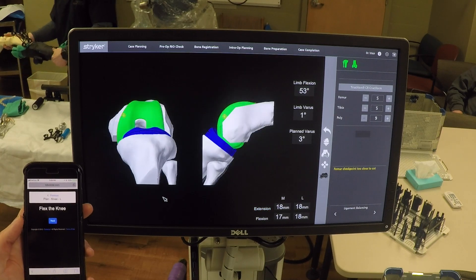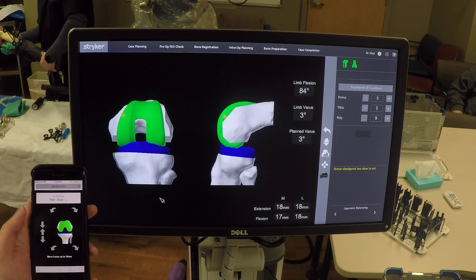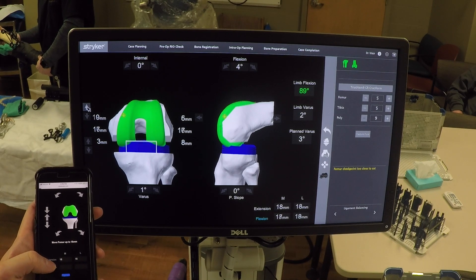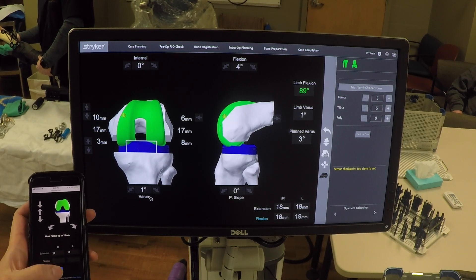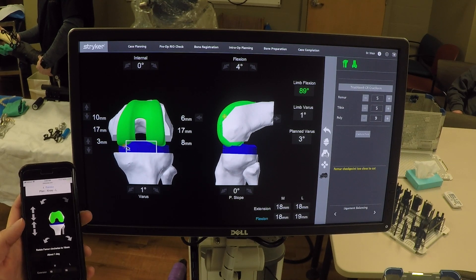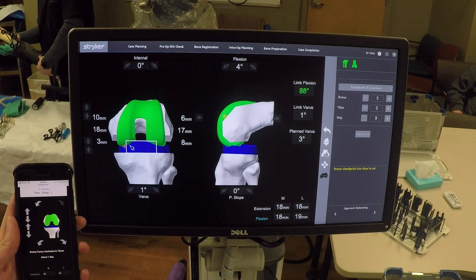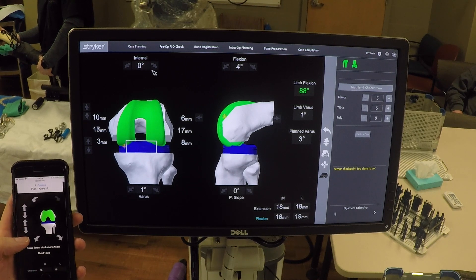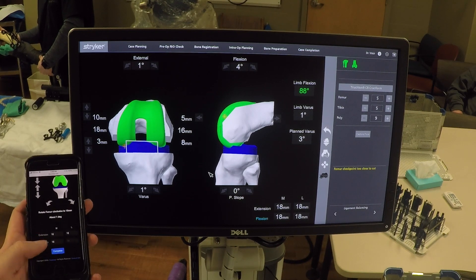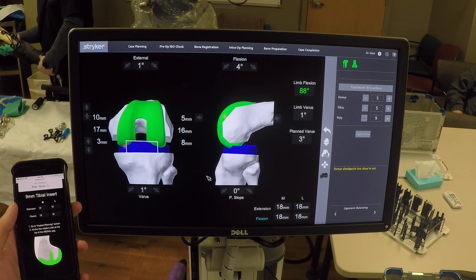We then flex the knee. We translate to 18 millimeters in the medial compartment, anchoring at the posterior aspect of the medial femoral condyle, then rotate clockwise one degree, achieving 18 millimeters throughout. This verifies that we will have a 9 millimeter tibial insert in this particular case.